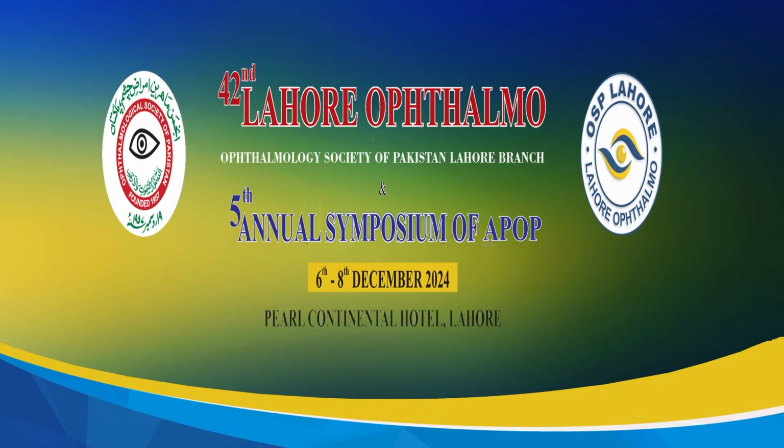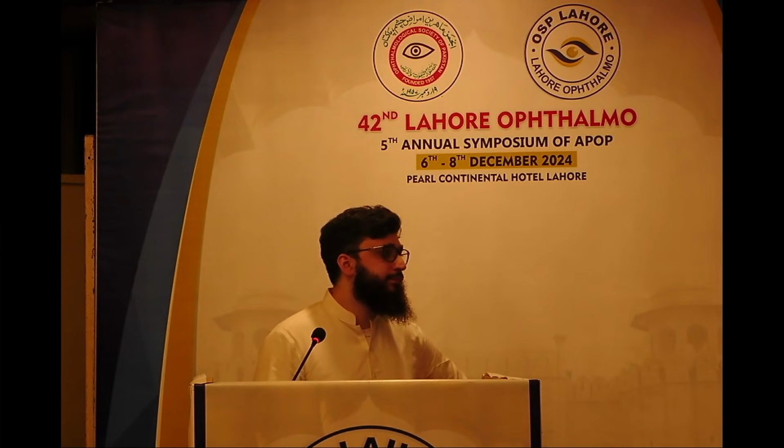So that's also very useful. It's personal preference. The BIOM system is, I think, the most common one. If you look throughout the world, it's used most commonly. But I find the IBOSS system to be the most convenient one because it has its own automatic inverter already incorporated in it. As soon as you put it down, everything is in focus, and you don't require any inverter. So it takes a little more space, but for focusing and everything, I find it the quickest and easiest one. We will see if there's any other opinion.